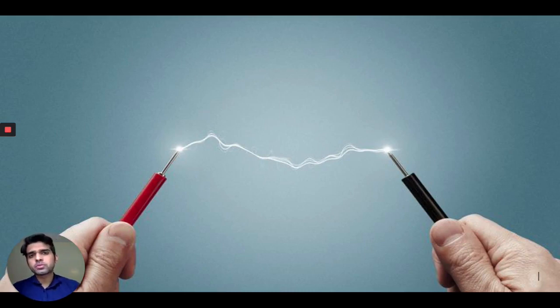But one of the main problems with current stimulation is that they are not very portable. The equipment's large and clunky, and not ideal for out-of-the-lab use. And what we're interested in is technologies for out-of-the-lab use that are portable.